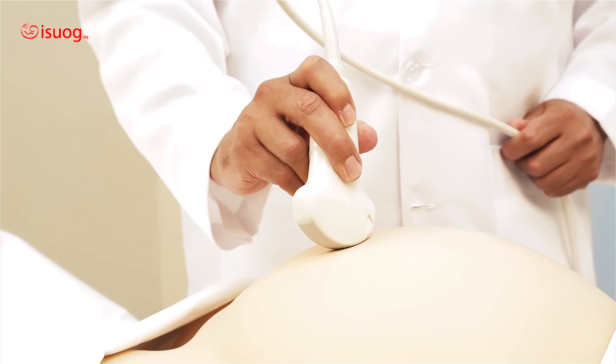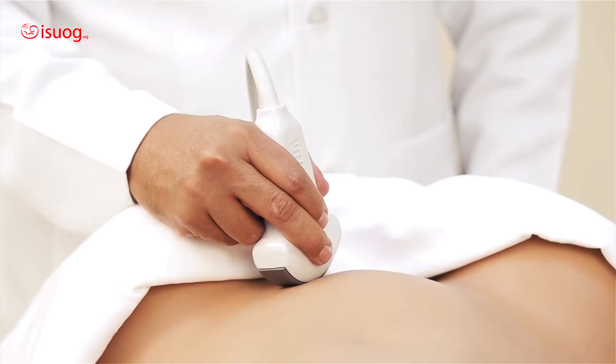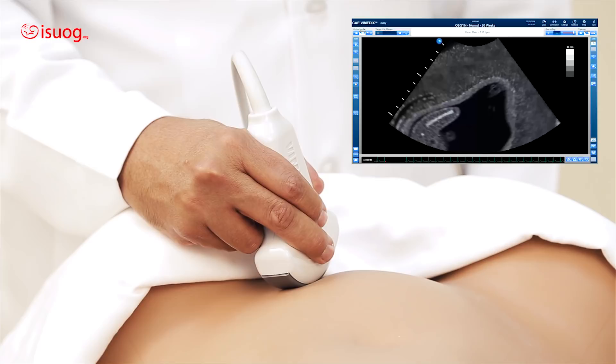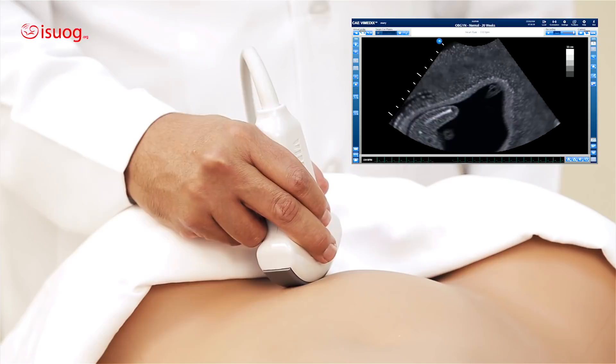I'm going to demonstrate how we apply dipping to correct our image. If you look at the screen, I'm trying to measure the femur, but the femur is not horizontal. To correct this, I'm going to dip. And as you can see, by dipping I have corrected the plane of the femur.